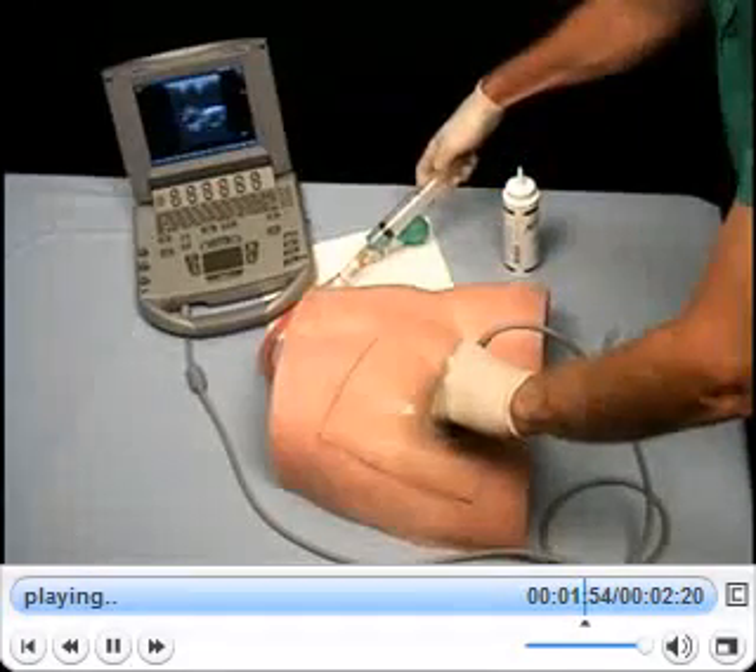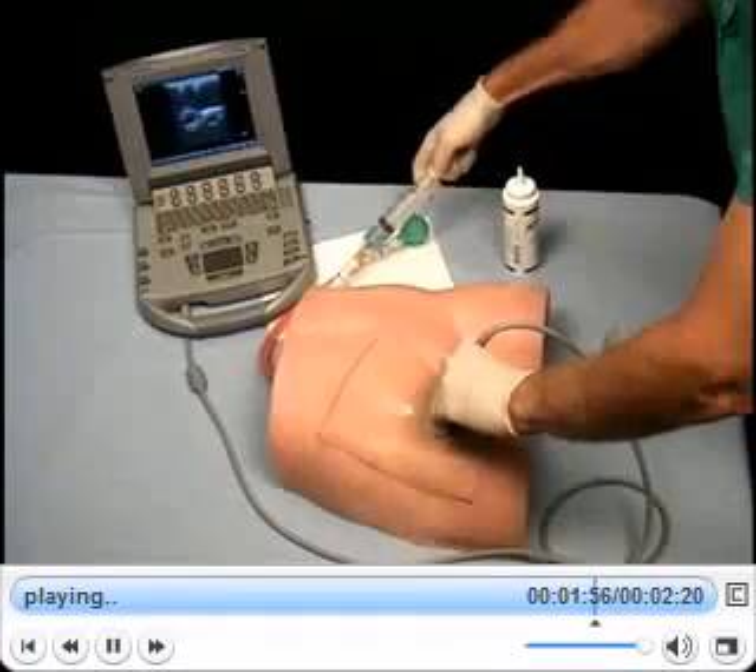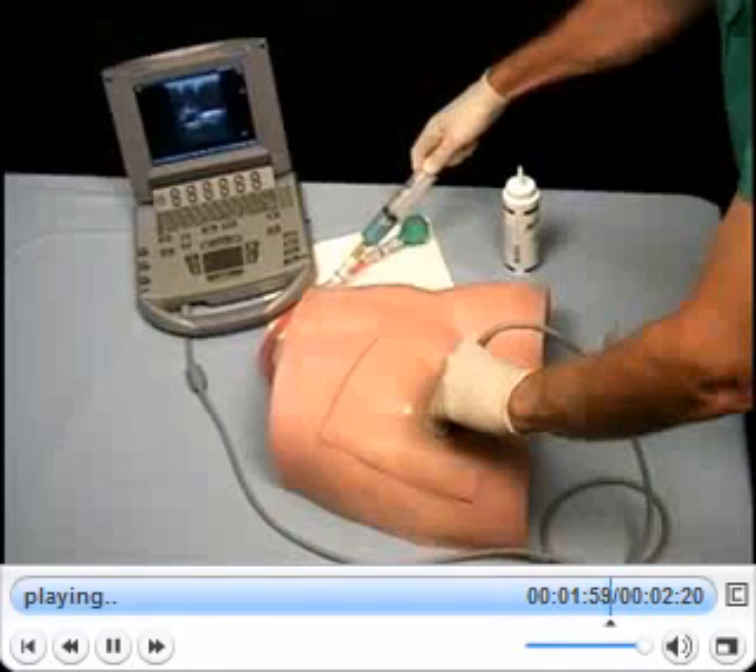You can use the syringe to lower the venous pressure to show low pressure complications. To do this, withdraw 20 milliliters of venous blood into the syringe. You should visually notice the vein flattening.